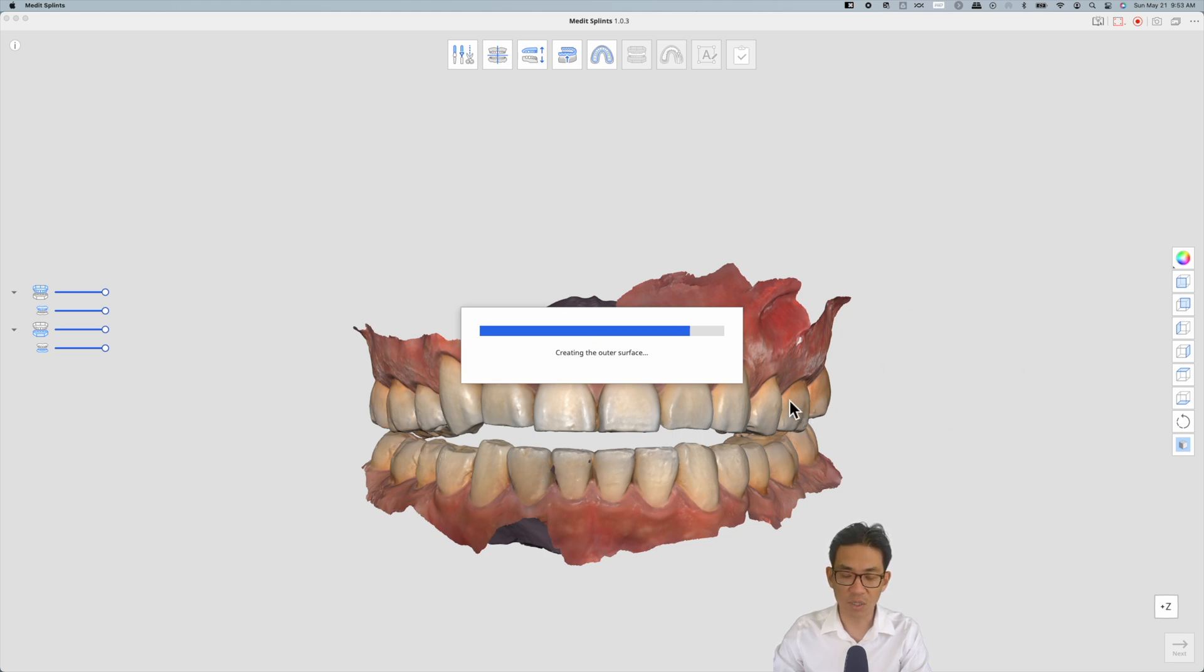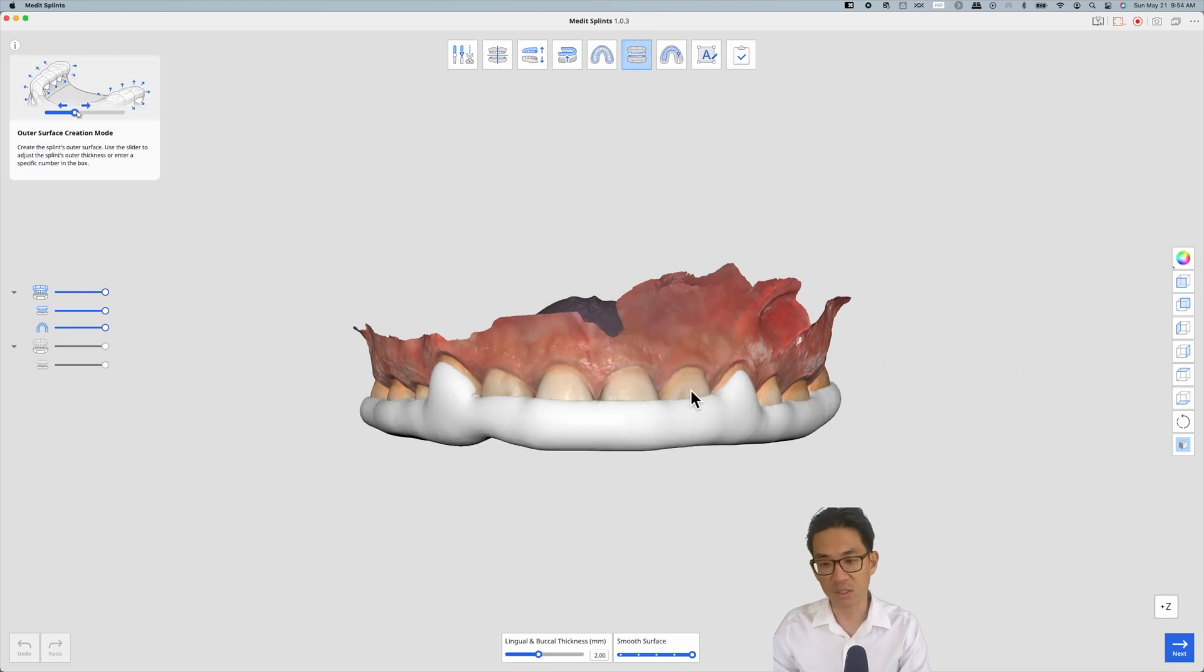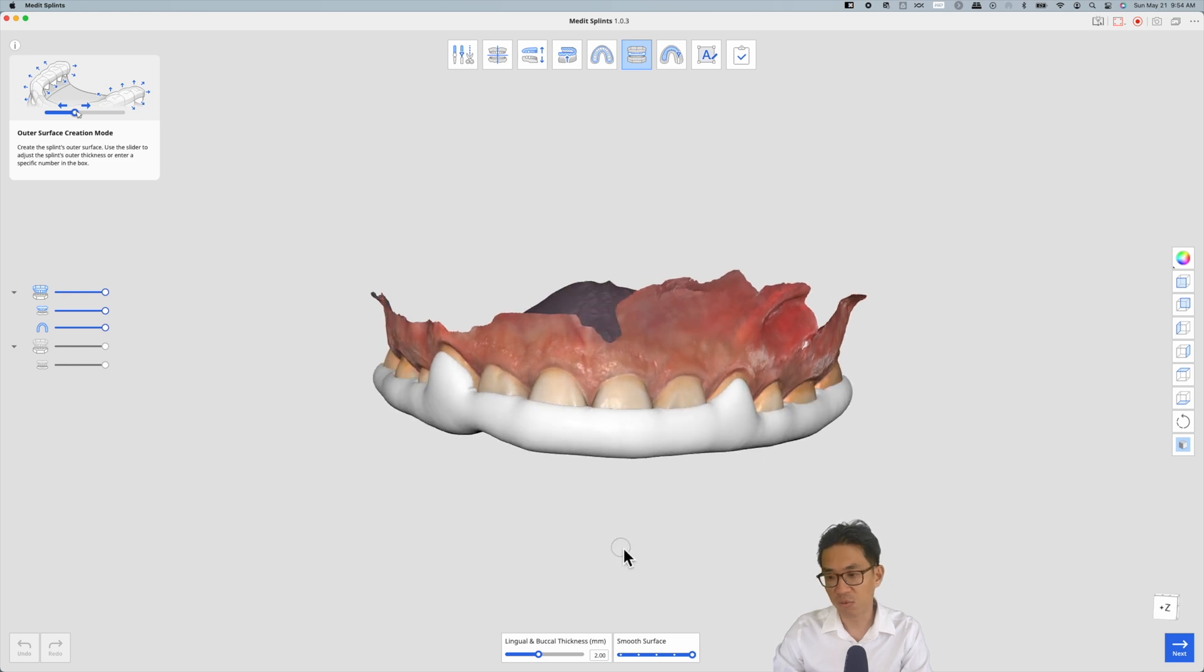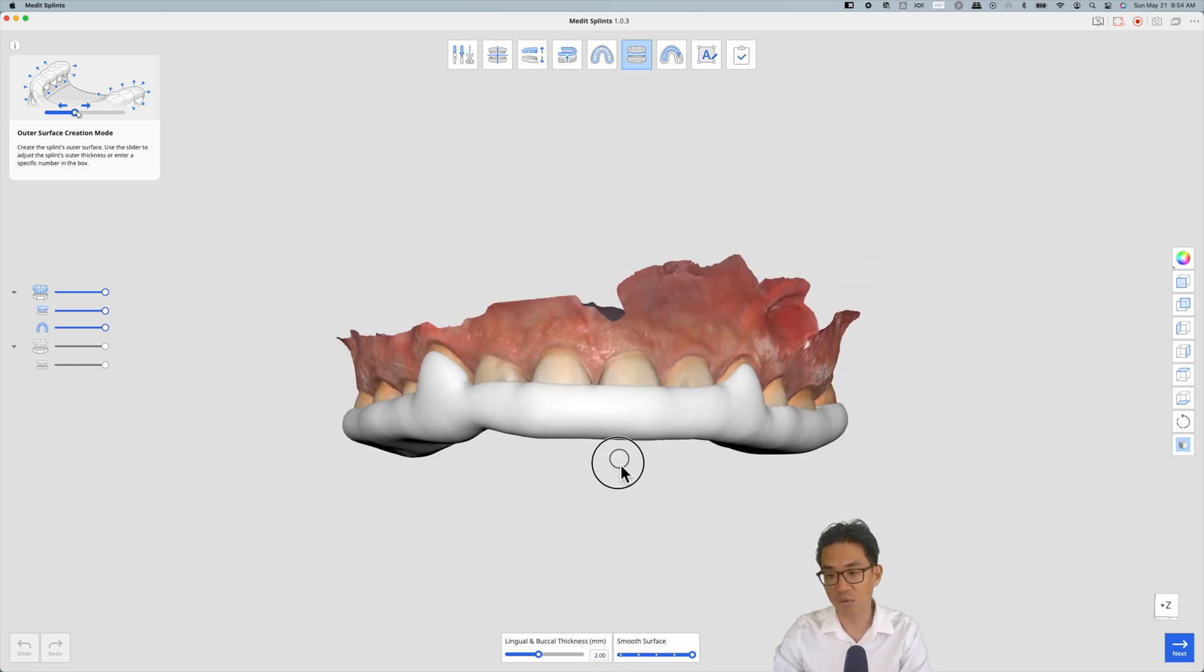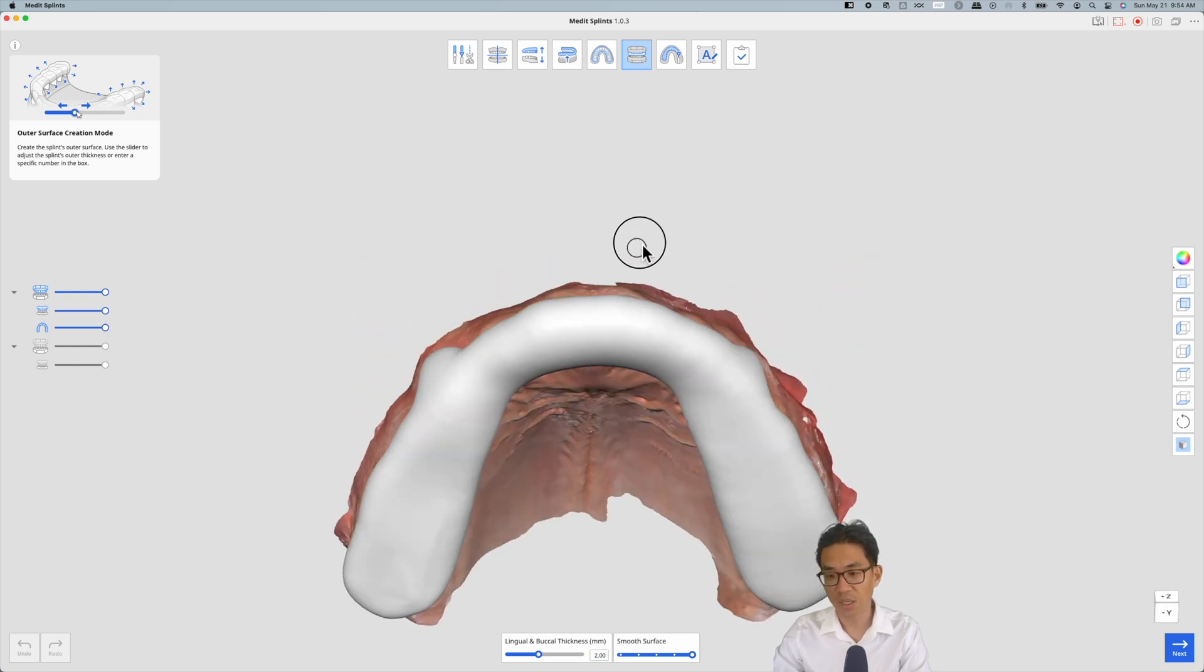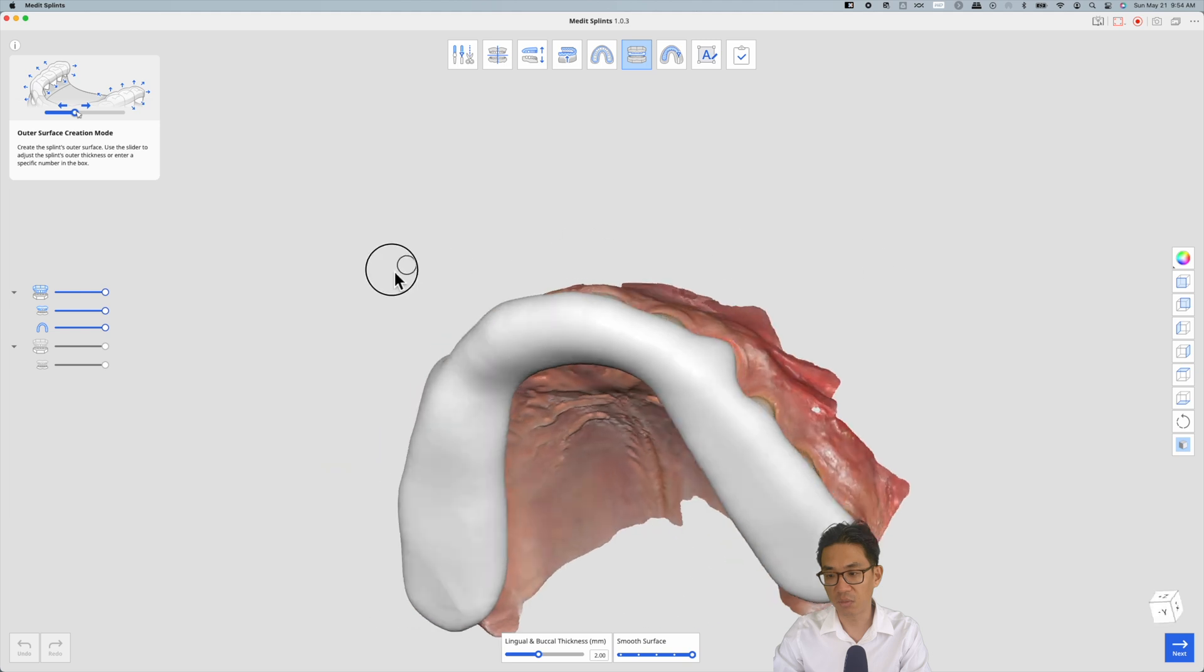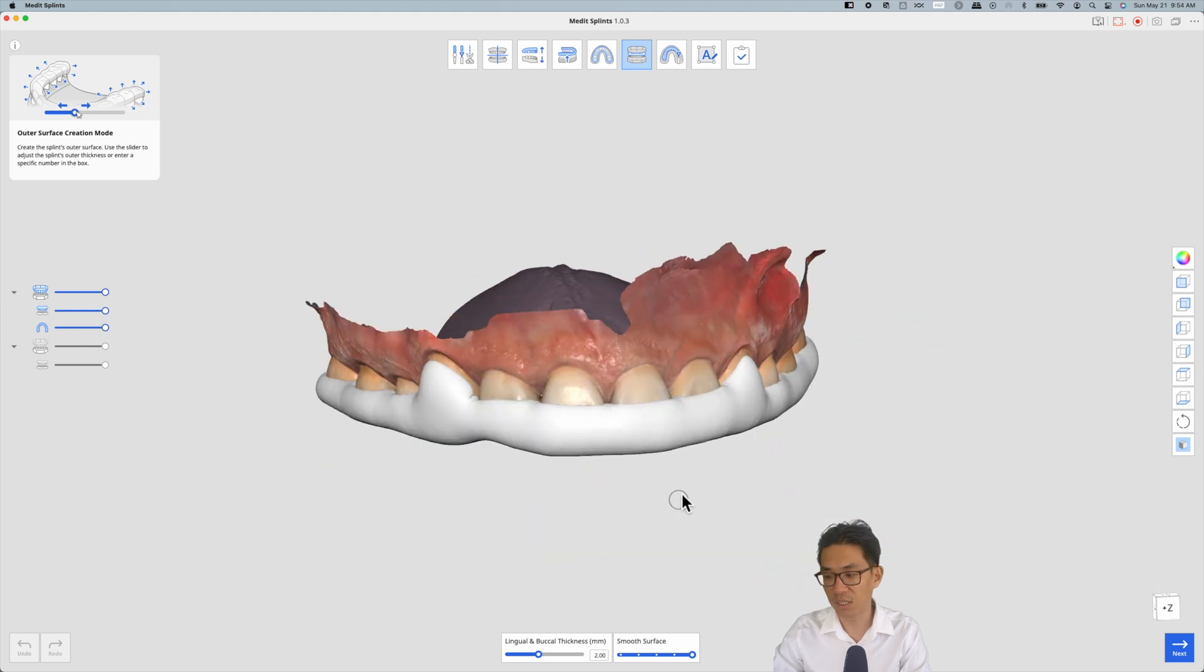We like to have the buccal lingual thickness set to two millimeters, and again smooth surface all the way max. I'm happy with how that looks. Hit next.